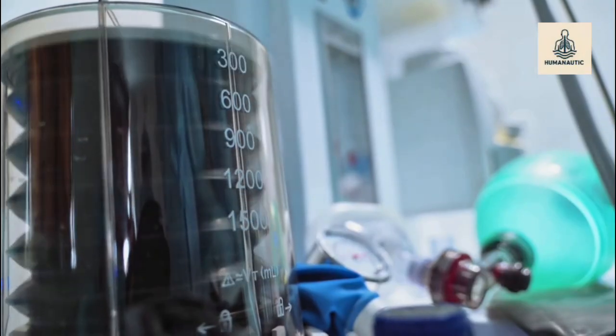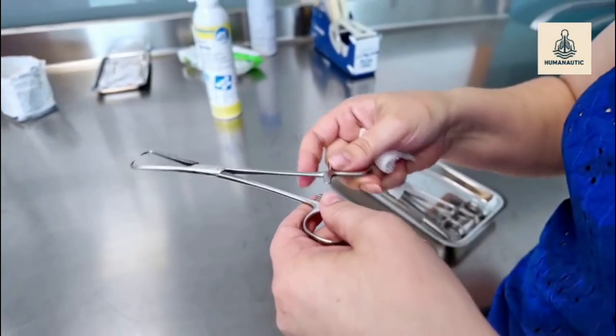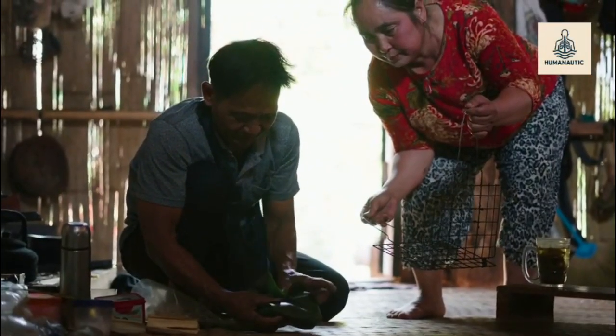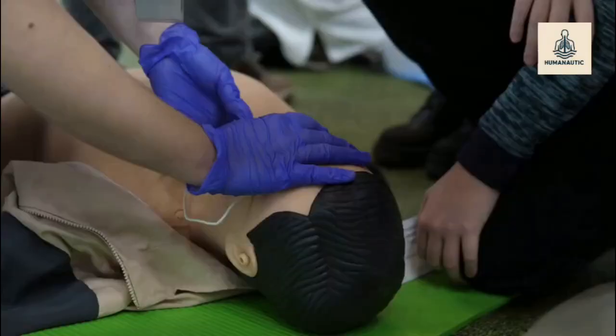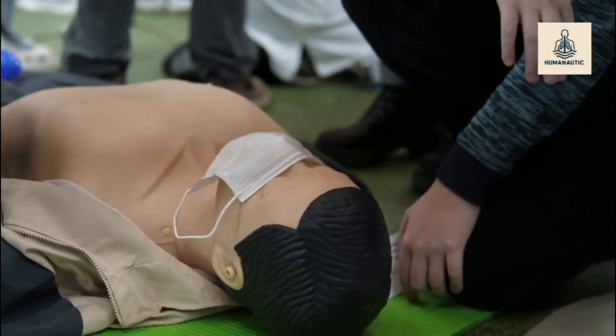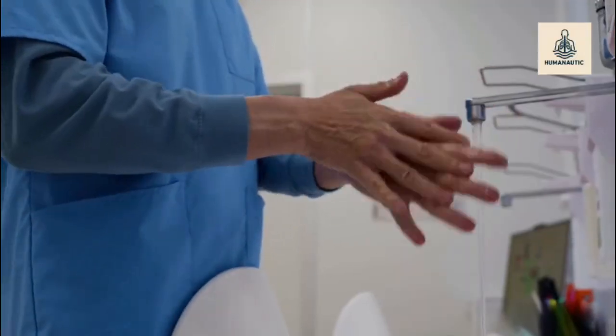Step 5. Creating the tracheal opening. An incision is made into the trachea, usually between the second and third tracheal rings. Different techniques may be used, such as a vertical incision, horizontal incision, or a Bjork flap. Air movement through the opening confirms entry into the airway.